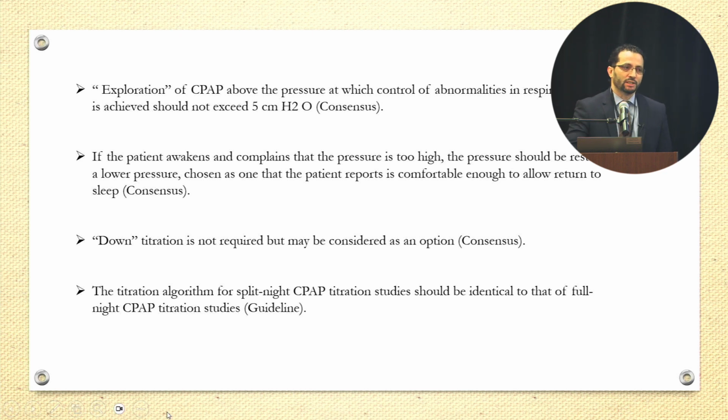Of course, if your patient wakes up in the middle of the titration and feels uncomfortable, or feels like the pressure is too high, you should go down to the pressure where the patient feels okay, so he can sleep and you can finish your titration.